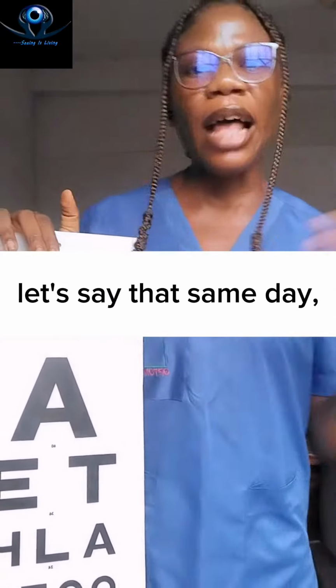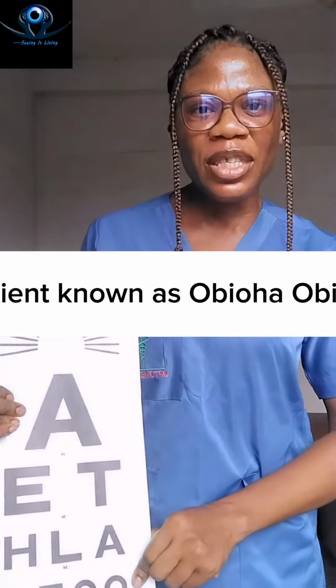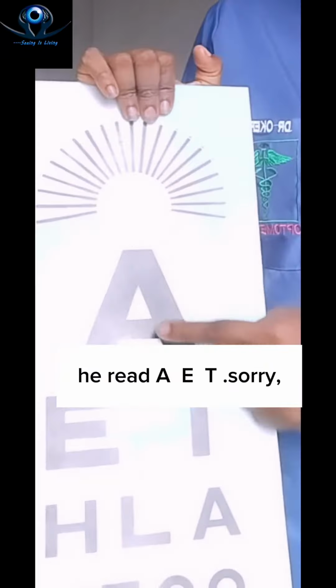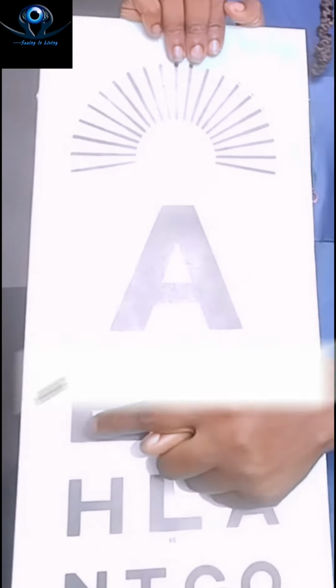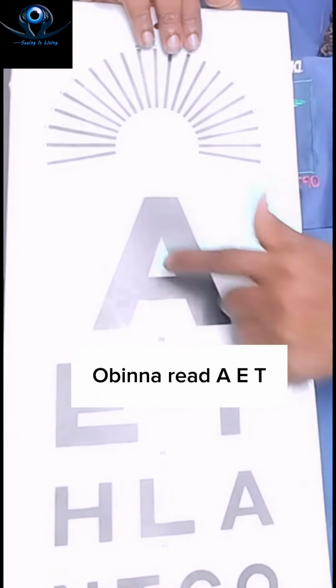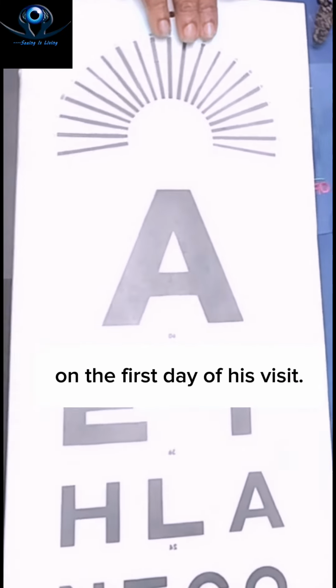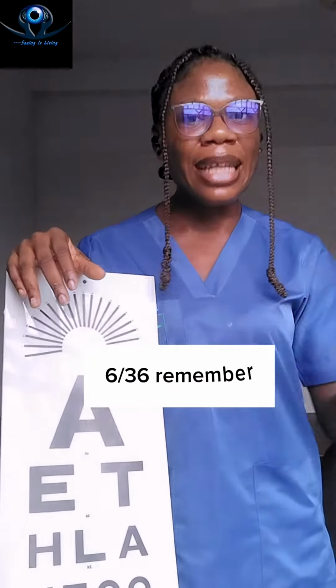Now, let's use another example. Let's say another patient known as Obioha Obina, the first day of his visit, read A-E-T. Sorry, this image is inverted. I don't have a cameraman yet. This is supposed to be A-E-T. Let's say Obioha Obina read A-E-T on the first day of his visit. This will be recorded by the doctor as 6/36.